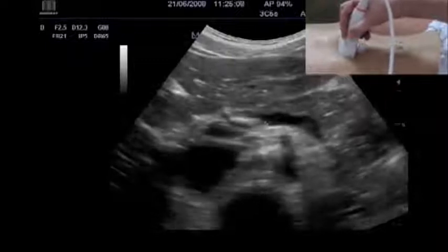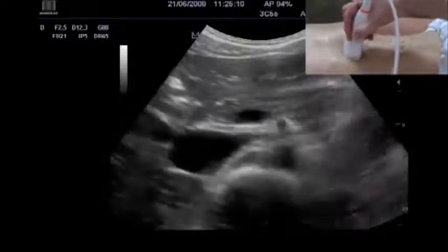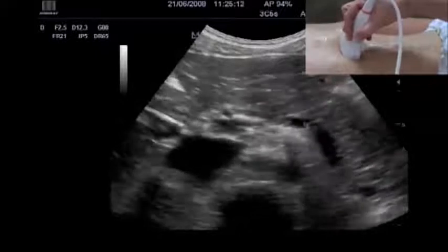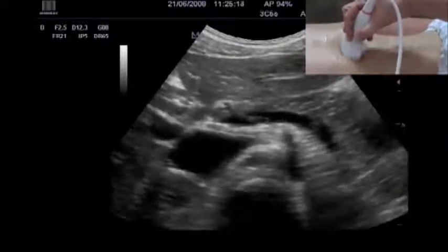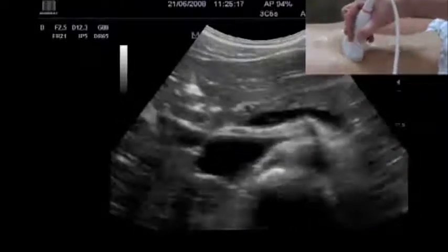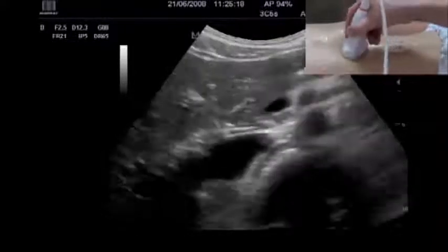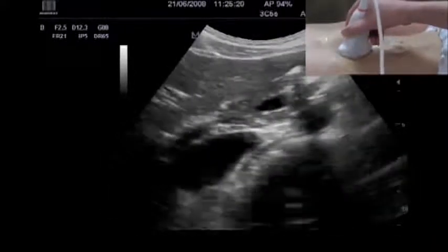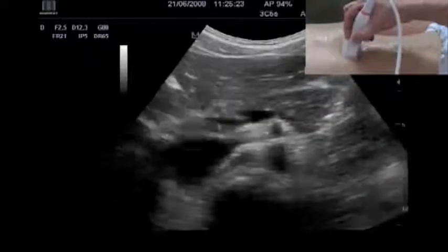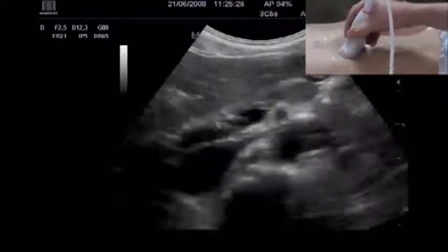When we move a little bit more caudally with the transducer, we see here a vein. This is the splenic vein, which will join together with the superior mesenteric vein to form the portal vein.